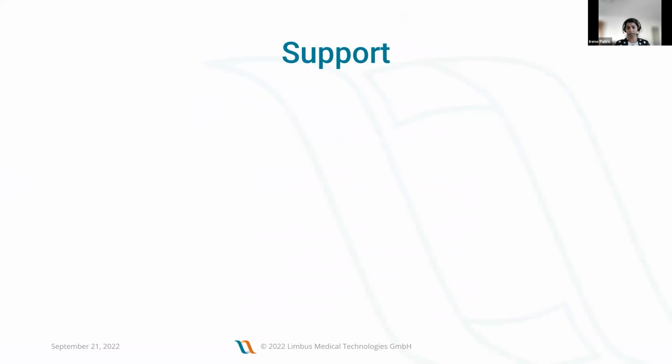And of course, support is a big part of our service. We have a group of experts who take care of everything from smooth onboarding to answering complex case-related questions. Because our team also has expertise in laboratory processes, we are able to guide the labs with improving their sequence quality by giving feedback and so on.